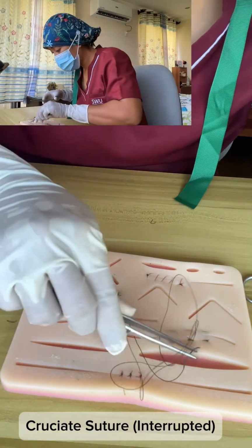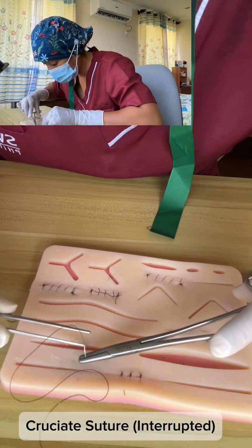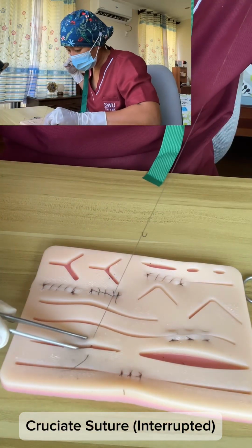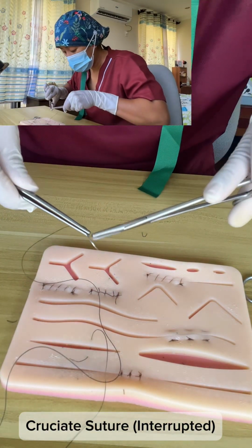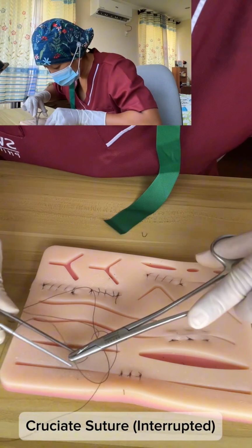Next is cruciate, which is interrupted. Cruciate is an appositional suture pattern. It is commonly used in skin closure. The cruciate suture is appropriate in skin closure because it provides good apposition of the skin edges for proper healing.